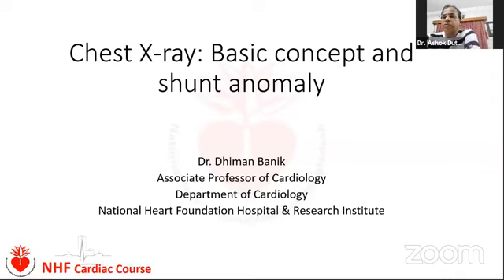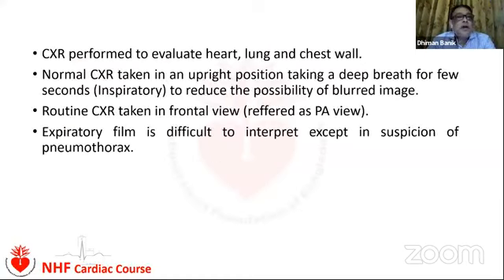Yes, visible. Respected moderator, respected panelists, teachers, colleagues, and friends. Today, my topic is on basic concept and shunt anomaly. Chest X-ray is performed to evaluate heart, lung, and chest wall. Normal chest X-ray is done in upright position, taking a deep breath for a few seconds, that is in the inspiratory phase, to reduce the possibility of blurred image.